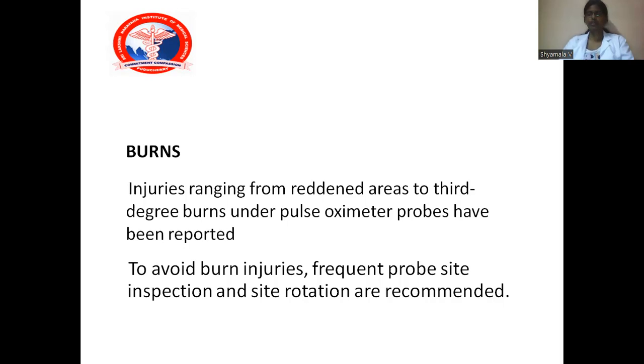The conditions where inaccuracy of pulse oximetry readings can occur include different types of hemoglobin, increased proportions of dyshemoglobins, severe hyperbilirubinemia, severe anemia, hyperemia, or nail polish or coverings over the nail.